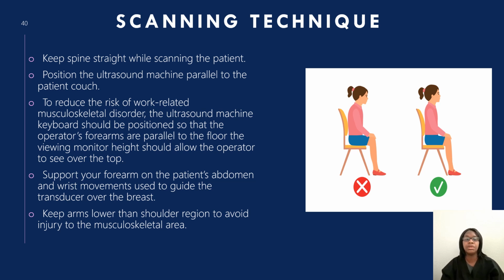When you're scanning, you want to make sure that you're upright. Use your wrist. Don't extend your arm up high. Keep it low. Keep your arm lower than your shoulder to avoid injuries.